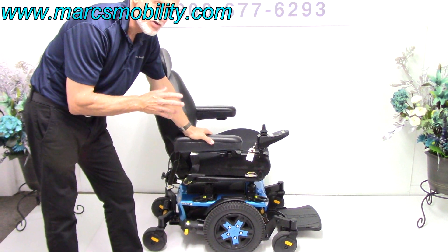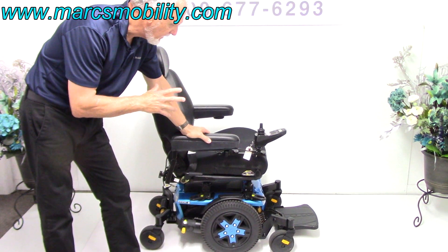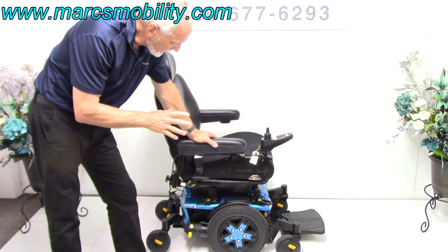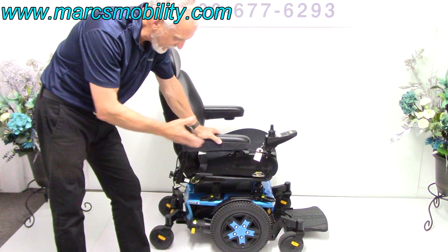This is the Quantum Edge 3. This chair is only a few months old and is in brand new condition — it was used less than a month. This is the Quantum Edge 3, the newest power chair that just came out with the newest base.